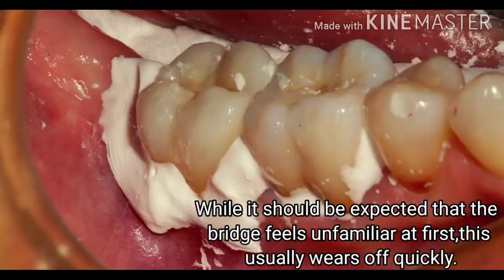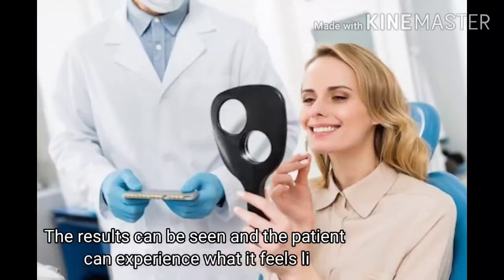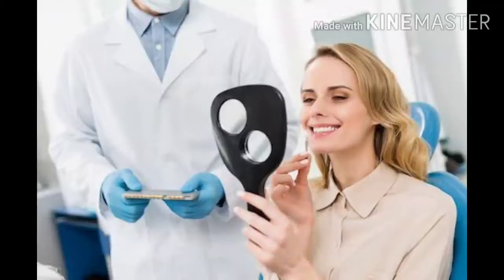While it should be expected that the bridge feels unfamiliar at first, this usually wears off quickly. The result can be seen and the patient can experience what it feels like biting the teeth together gently.